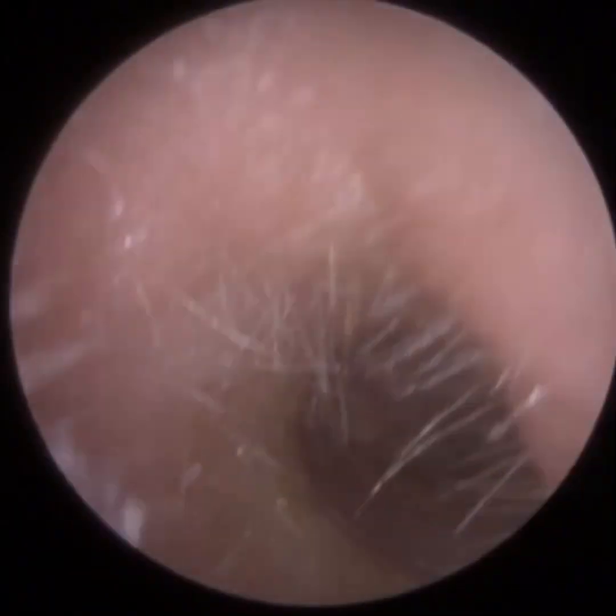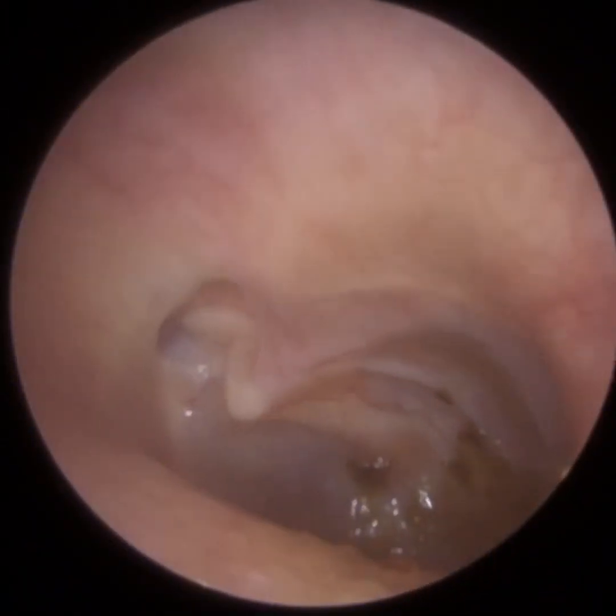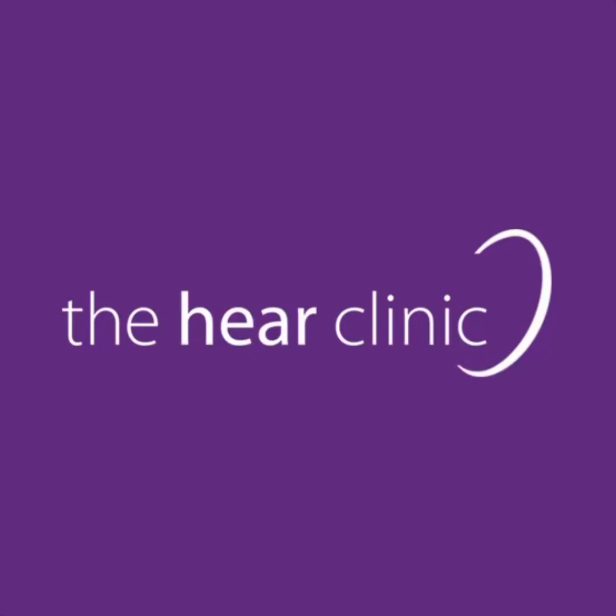Someone wanted to know why I didn't use this, I'm not sure of the device they're referring to, a blue rubber plunger for the last video, which wraps around the wax. It would have been uncomfortable for the patient, I think, and it's going to graze the canal wall, cause bruising, so that's probably why.